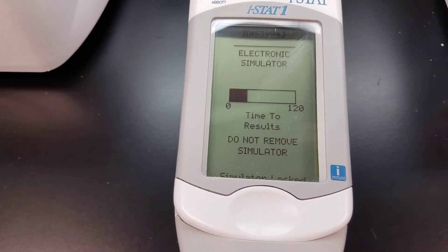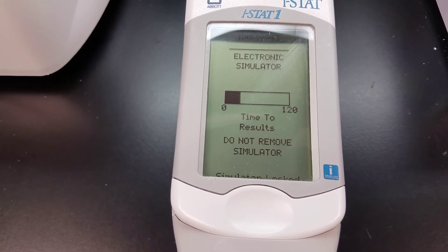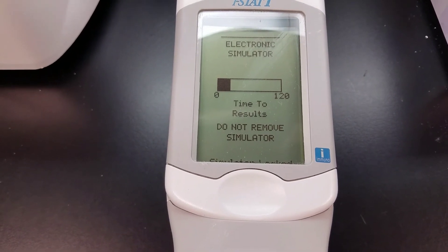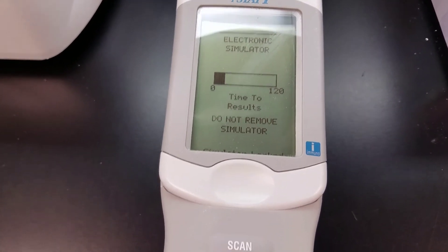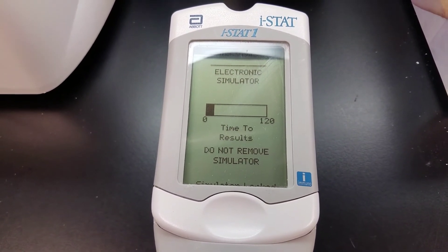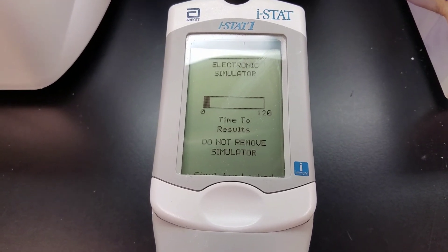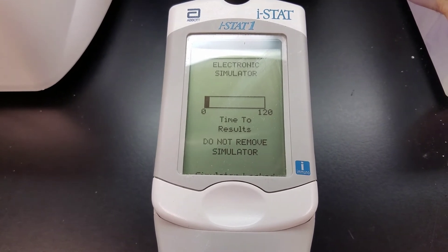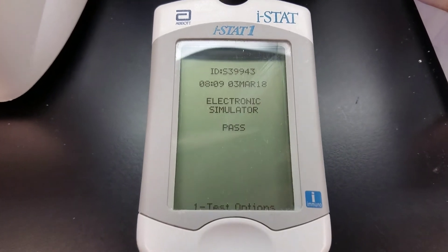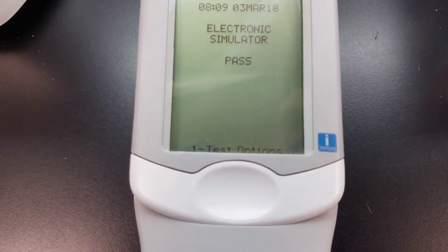We're almost done — shouldn't take more than about 30 seconds. You can hear it making the cycling noise. It beeps when it's done, and it gives us the time, says 'electronic simulator,' and it passed.